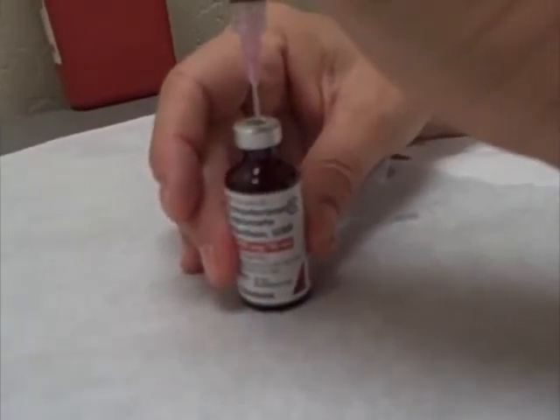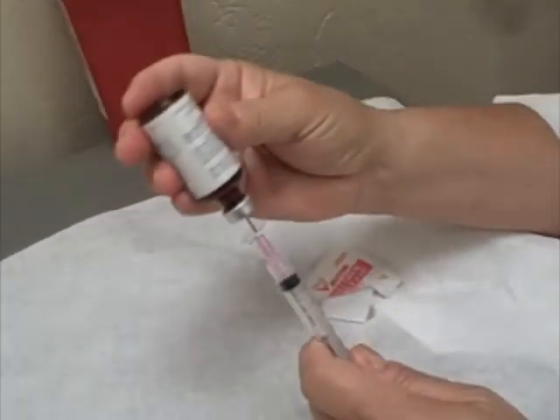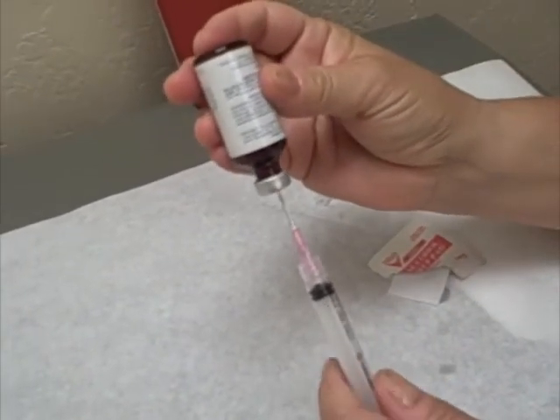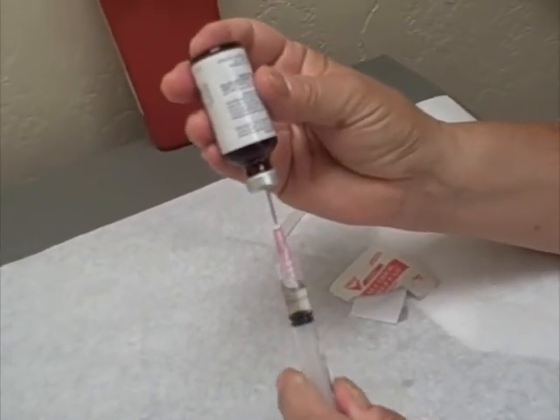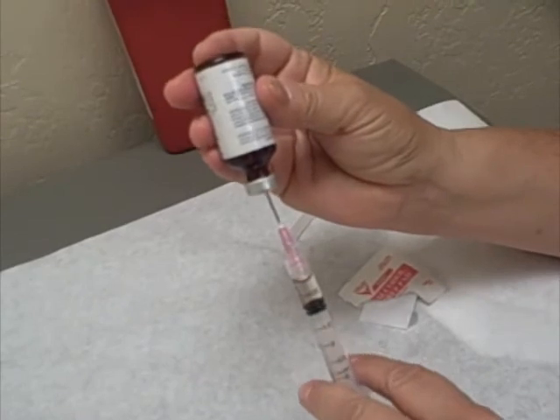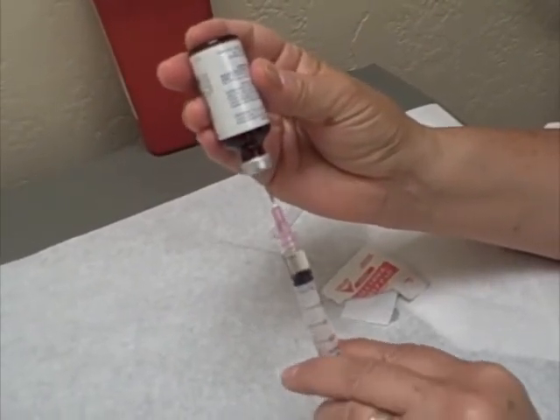There's both multi-dose bottles and single-dose bottles. And with the needle within the solution, you're going to be pulling back on it. Now this is a large needle, so it's filling pretty easily. And what I'm going to do is push it back to the exact dose that I'm prescribed.